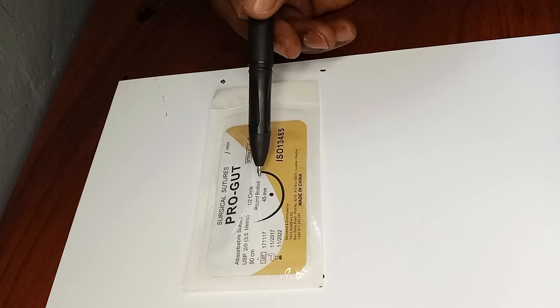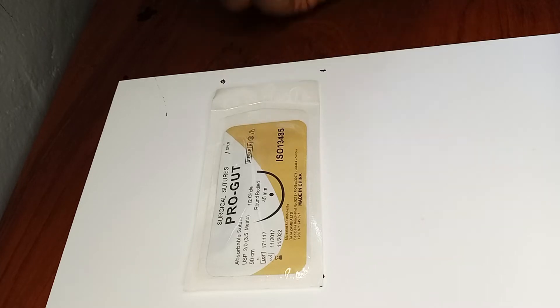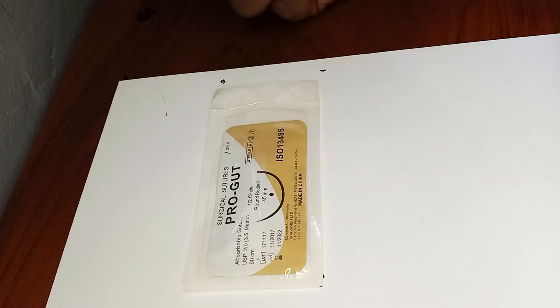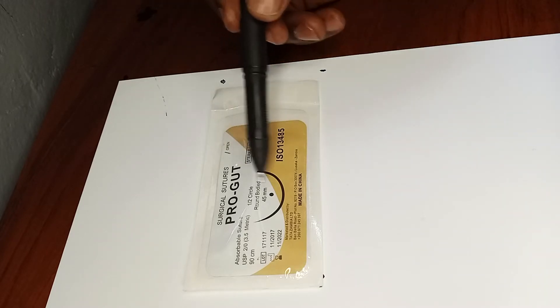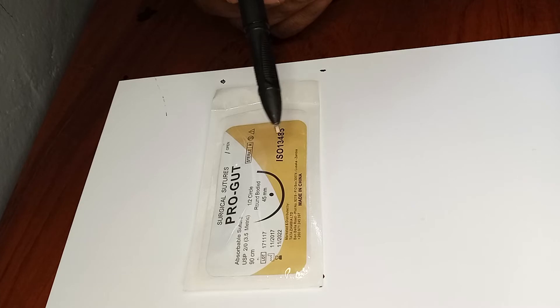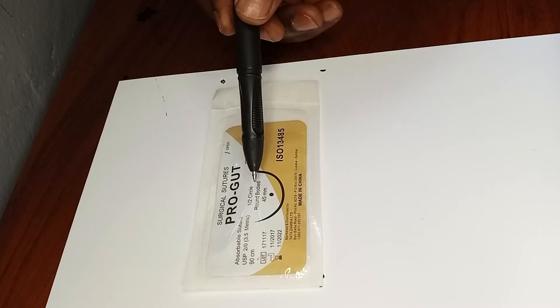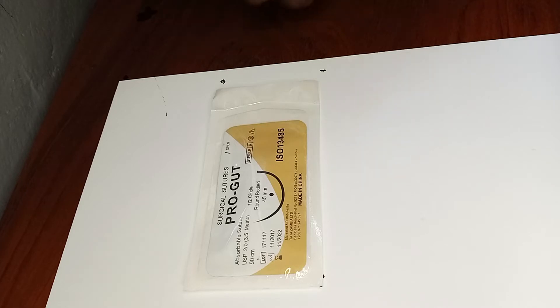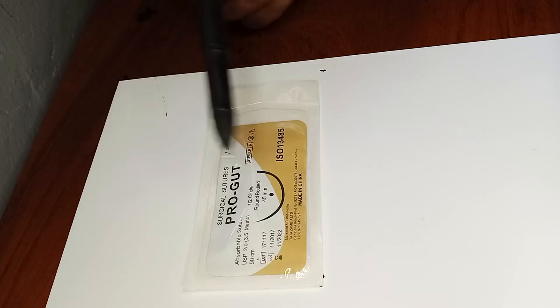This is a half-circle, round-bodied needle. Round body means it's not cutting or reverse cutting — it simply perforates the tissue rather than cutting through it. So if you are suturing through fragile tissues, you don't want to use a cutting needle; you want to use a round one that is less traumatizing, just perforating the tissue.